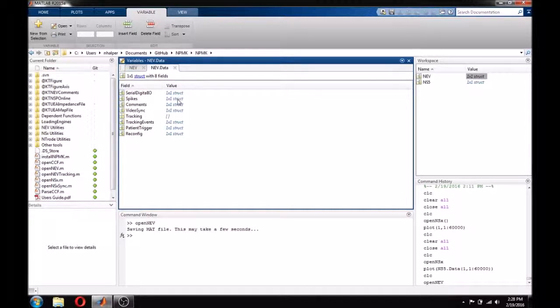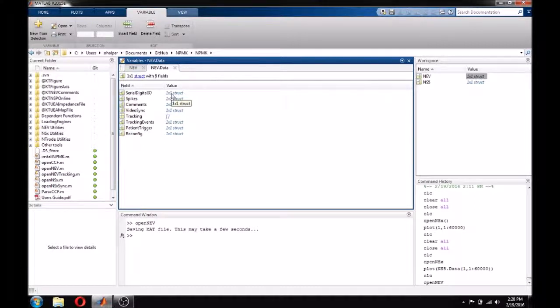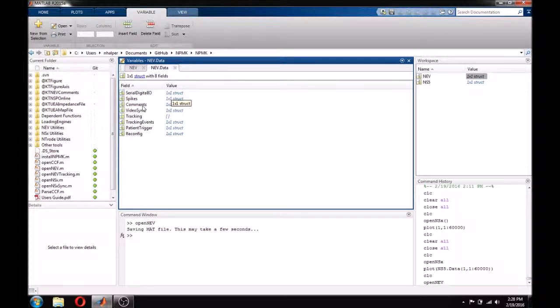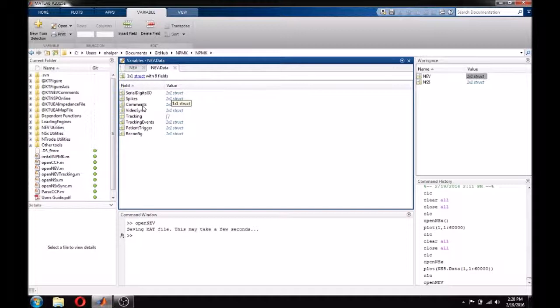SerialDigitalIO contains all of our serial inputs and digital input data. Spikes contain spike data, and comments contain any comments that we committed to the file during recording. To learn more about comments, check out our series on the basics of Central.